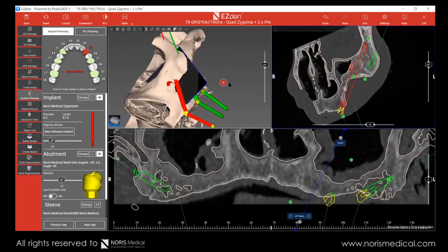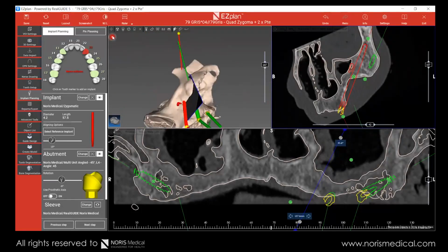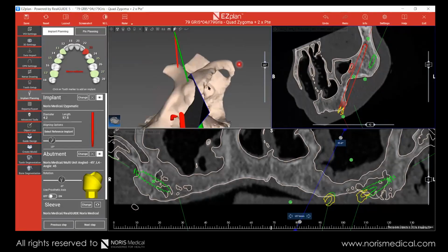If we were to be very close to the orbit and we look from here, you see this line actually takes us very close to the orbit. So we might think, that's what I explained before, that we're not in the orbit here, but actually we are. Okay, so we need to make sure that we're at the right distance here. You see this, how close we are?